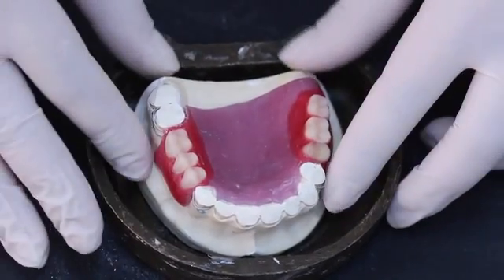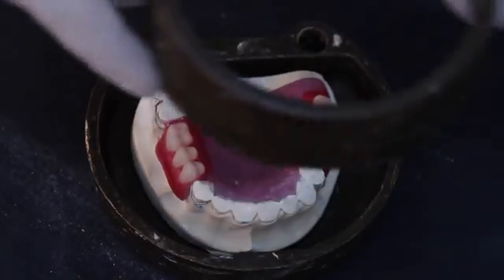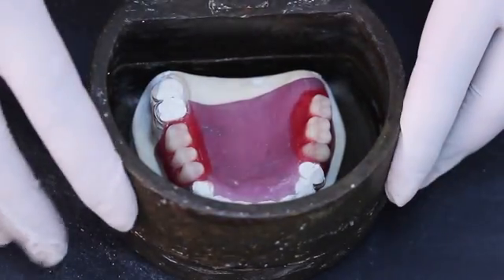Note that there must be approximately 15 mm of clearance between the occlusal surfaces of the teeth and the top of the flask's middle segment.